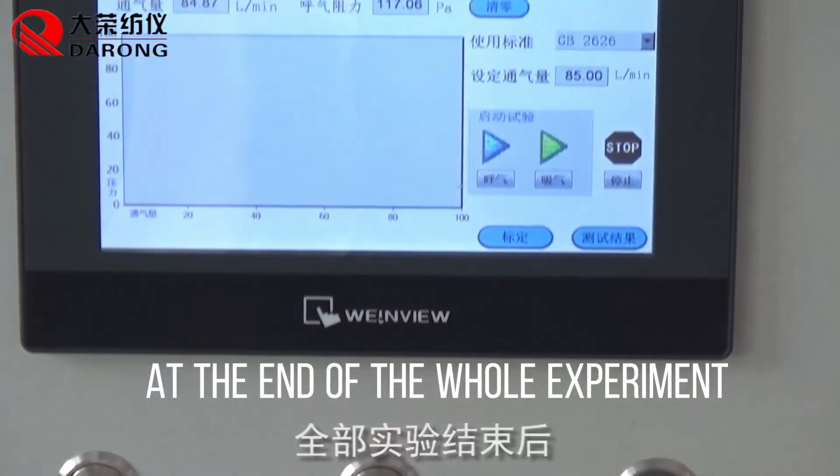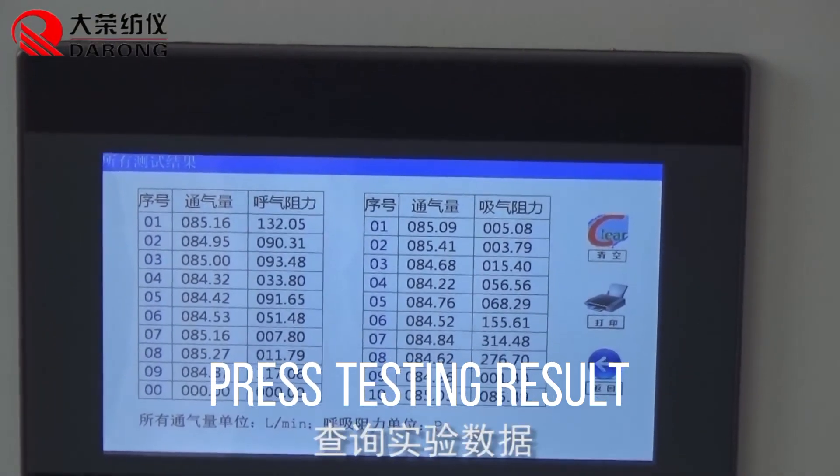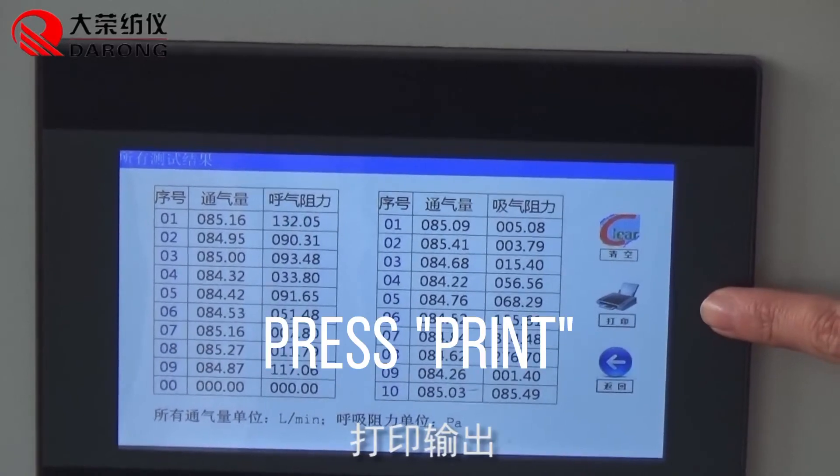At the end of the whole experiment, press testing result to view the results. Search testing parameters as needed, then press print.